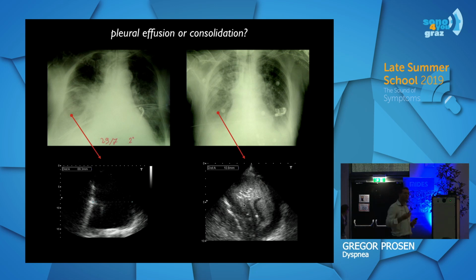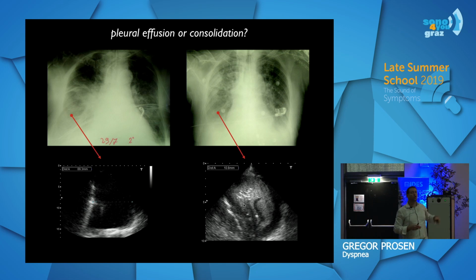What's that? Trapped air. Where would air be trapped in pneumonia tissue? How is this called pathophysiologically? Yeah, you're completely correct. But where is air trapped? Mostly, and such big chunks of air. This is air bronchogram. You heard about air bronchogram in Röntgen? Yeah, in upper levels you will. Now you can see this white, hyperreflective, is air trapped in the bronchi. And it's quite specific for pneumonia. Okay, this is how pneumonia looks like.